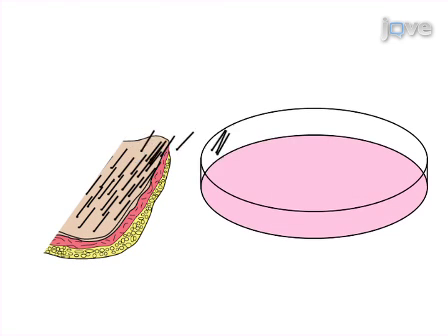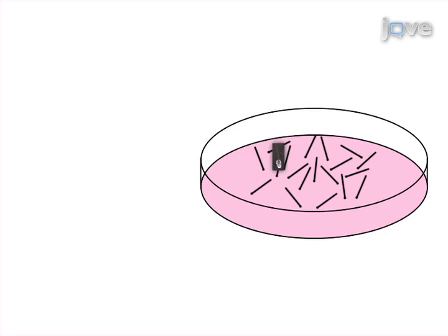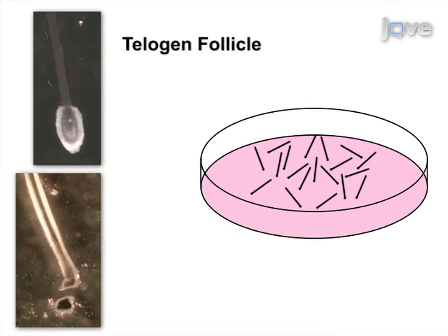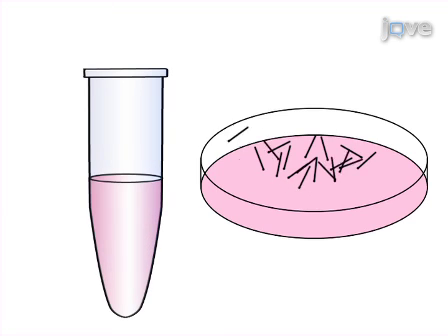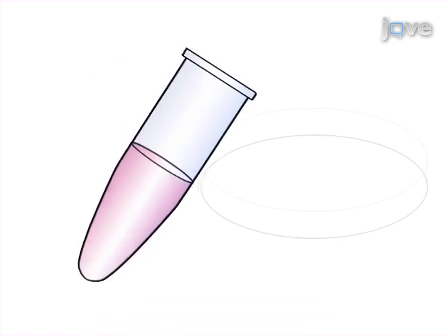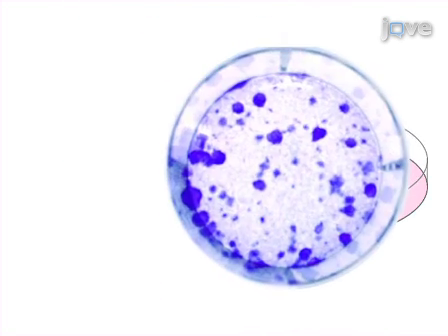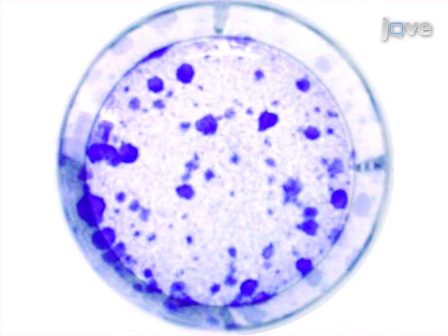The skin is then rinsed in fresh media and the hair follicles are plucked. Next, follicles are separated into telogen and anagen follicles by examining them under a dissecting microscope. The final step of the procedure is trypsinizing follicles into single cell suspension and plating in culture dishes.